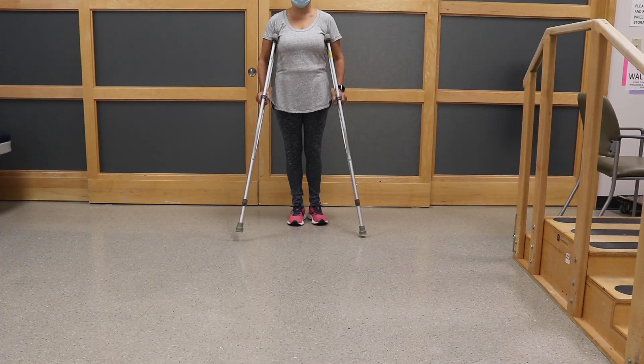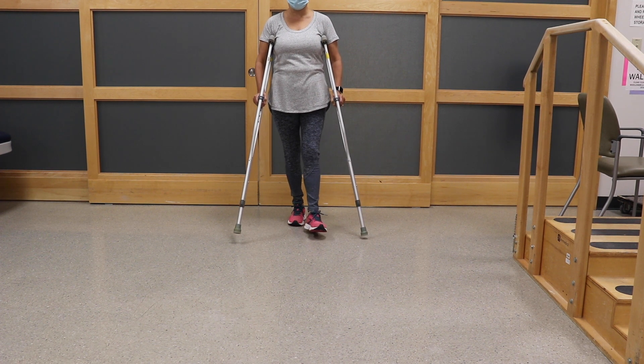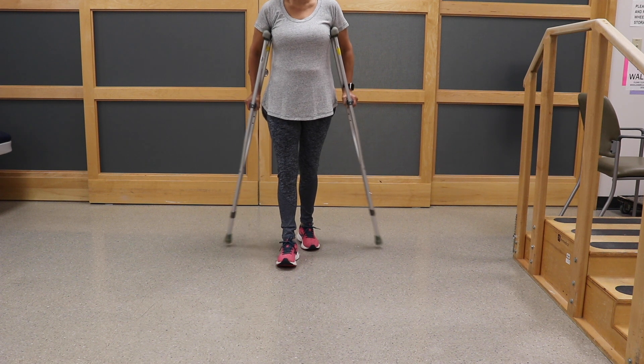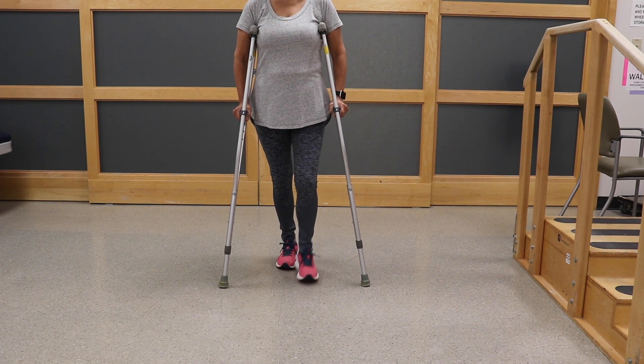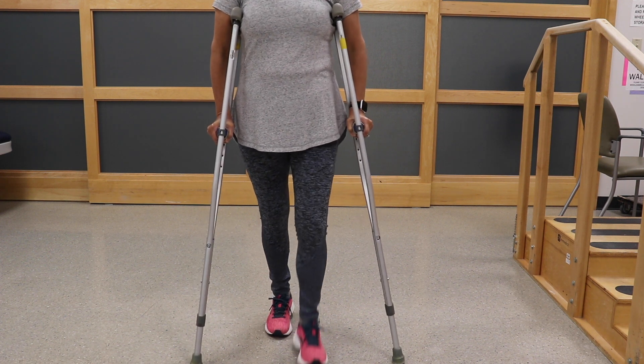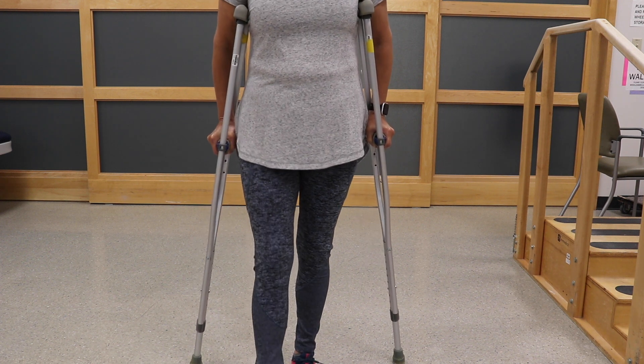If you have a total hip replacement, you may use crutches instead of a walker. If you already have crutches at home, use those, or we can provide them for you and bill your insurance. Your physical therapist will determine which device you should use.